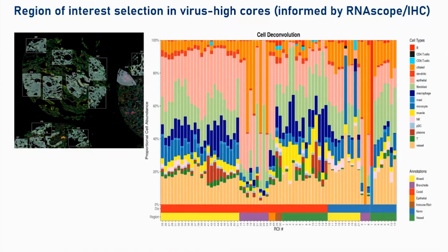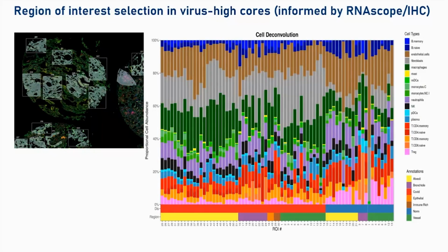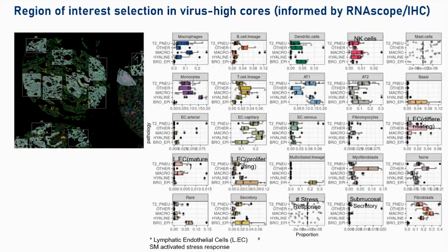And so we could then, using CIBERSORTx, we could see going across here in the red is COVID, blue is normal. This is just doing a cell decon on the different cell types within the regions of interest. We can take this a step further and do an immune cell decon to look at the immune cell subtypes within each of the regions of interest within this tissue. And this is just annotating that a level deeper.